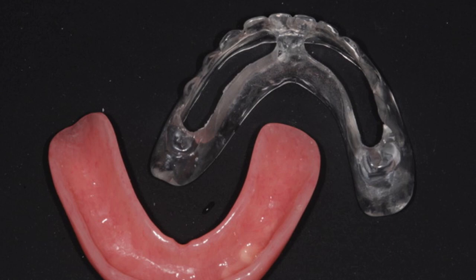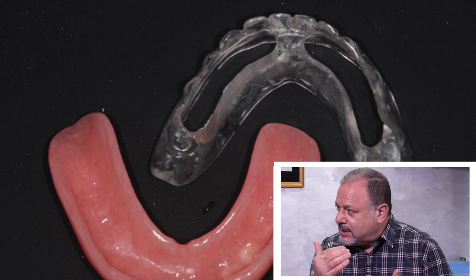That we'll be picking up with the attachments. And then we have a surgical guide. There's various types of surgical guide. This is a clear acrylic that I can take measurements from my scan with. I can measure from the crest of where her incisal edge of her teeth are pre-surgical, and then I can score the bone so that I know how much to reduce.